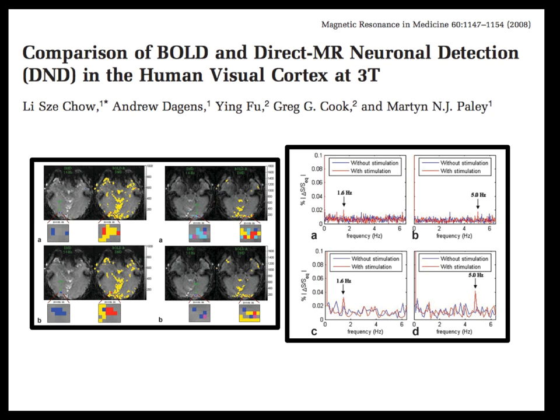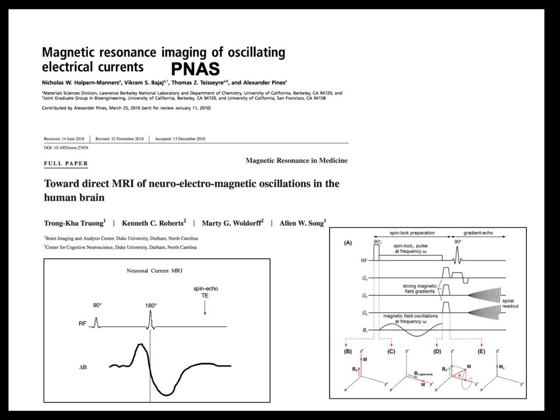So there are papers like this where you look at it and say, that's kind of cool, but not much that says, wow, this is real. So the field's about at that point. That paper, along with a lot of other papers, just relies on simple image acquisition, where you're hoping the acquisition, in this case a spin echo, lines up with when the phase is shifting, right when the neurons are firing. By probability that might happen, but you're missing a lot of signal.